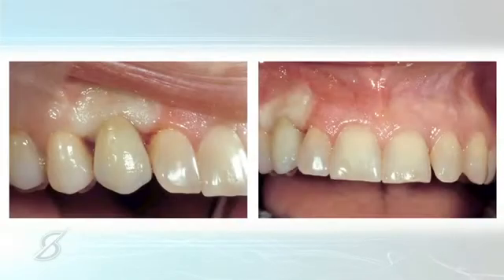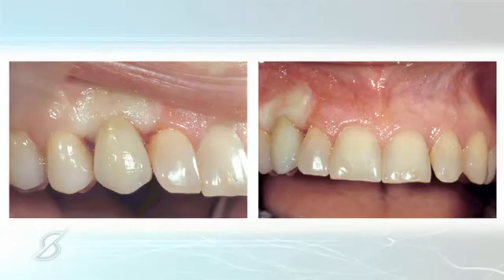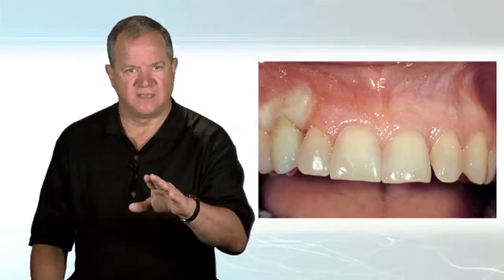Now in this instance, as you can see in these two pictures, there's significant blanching going on around that restoration. So this is the exact same restoration that was there, but with the composite added several millimeters up. And just screwing it to place, it's already raised the gingival margin significantly. Now, somewhere along the line in dentistry, I remember being taught that if blanching doesn't go away in 10 minutes, you have too much pressure and you need to take away contour. I have no idea where that came from, because I can tell you these kinds of cases do phenomenally well. The tissue ends up looking beautiful. So what I do is screw it to place, patients anesthetized obviously, and then send them home.